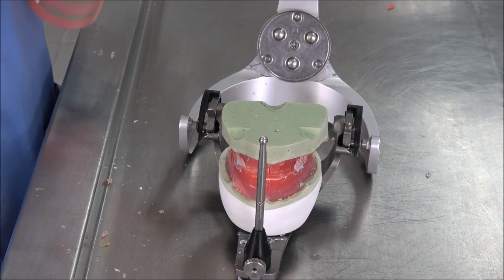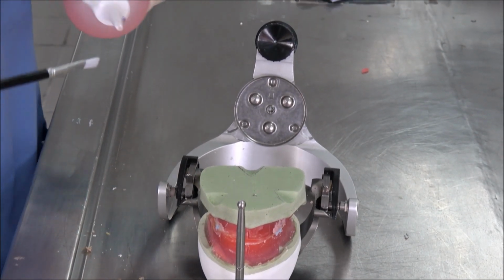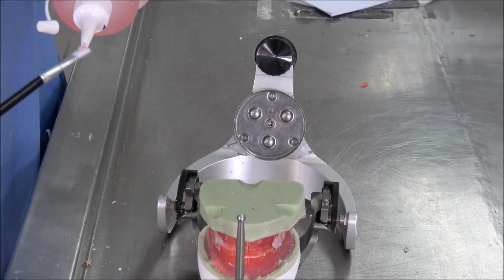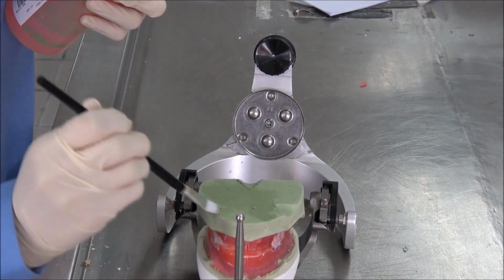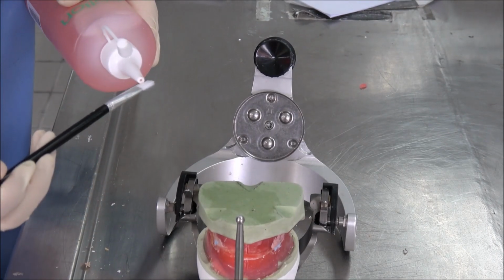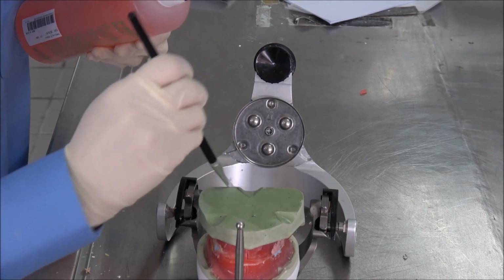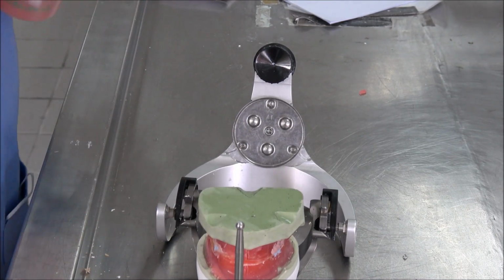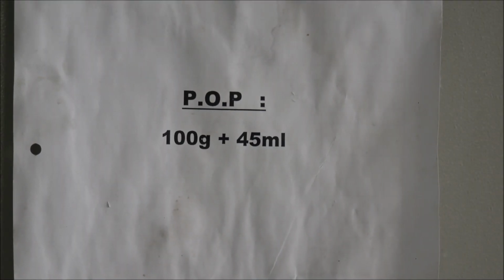We have to apply a very thin layer of sealer on the denture, on our model base. Just a very thin layer around it as a separating medium. Just a little bit. For the ratio of POP, we are going to use 100 gram POP to 45 ml liquid, the same as our upper model.